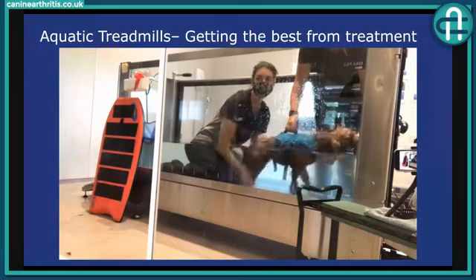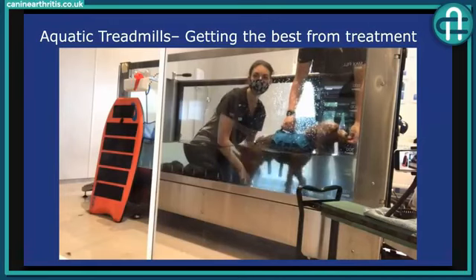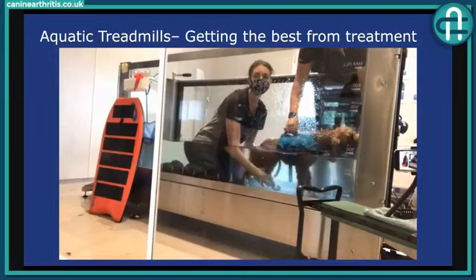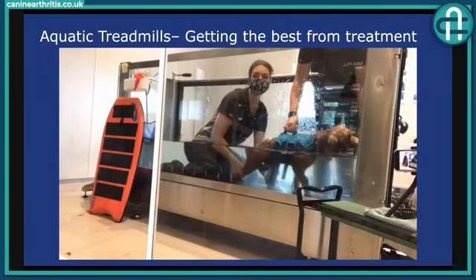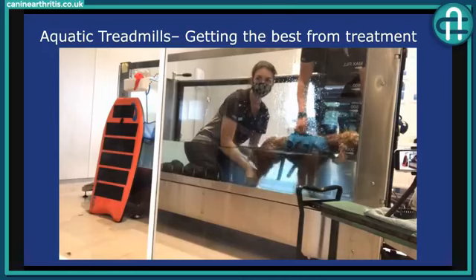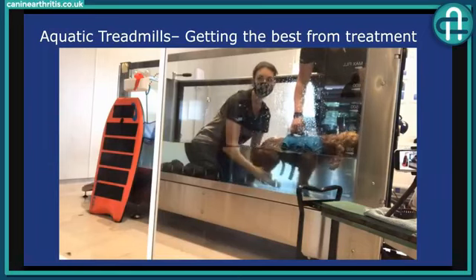So the other things that we can do, you're seeing Remy here applying therapeutic handling techniques, but not only that, in the water you can also use myofascial techniques and soft tissue mobilization techniques. You've got the thermal heat that you're getting from the water as well. And also you can do some joint mobilizations within the water, for example, active and passive range of motion to try and restore those movements that you might have lost or are losing, or to maintain them, particularly in the osteoarthritis case. So there's so many things you can do with an underwater treadmill.